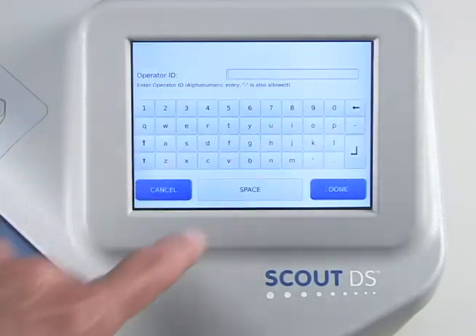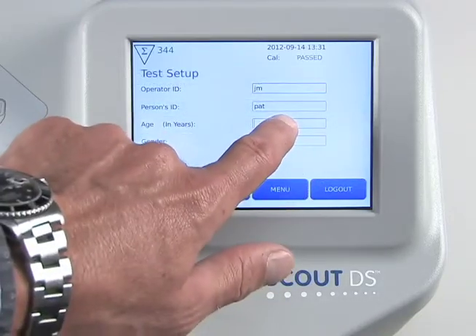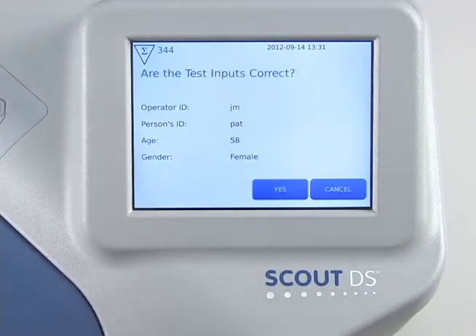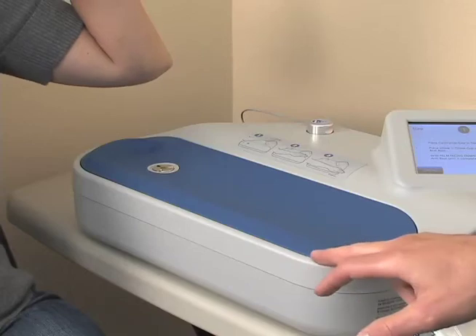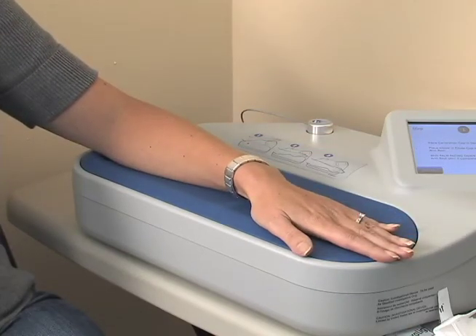First, enter an operator identifier, a patient identifier, and the patient's age and gender. Next, when prompted, remove the calibration cap and have the patient place their arm on the armrest. It's just that simple.